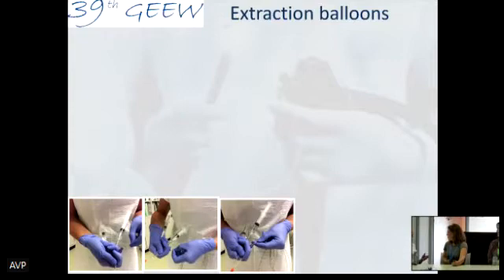It depends what we want. Depends what you want. Usually the balloon inflates. So the balloon inflation is usually in the belly, but you have to put the guide wire and you want the injection when you come out. Yes, when you use the belly, you adapt the balloon, you inject the contrast, and you push a wire. Normally you need 3 hands, but use the belly. Yeah, you're working on the belly.